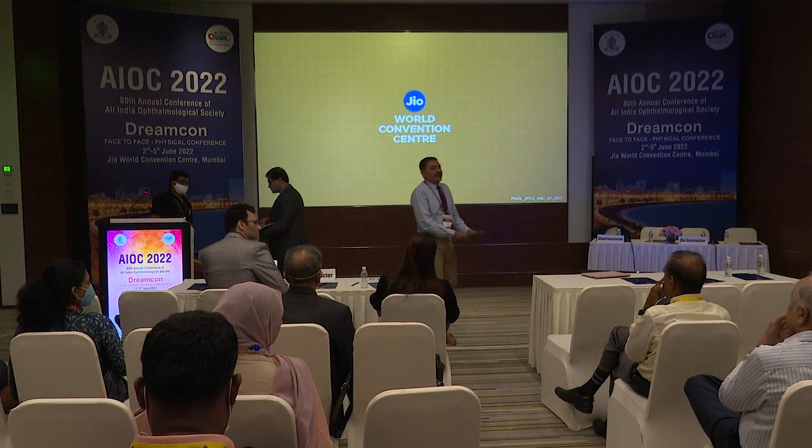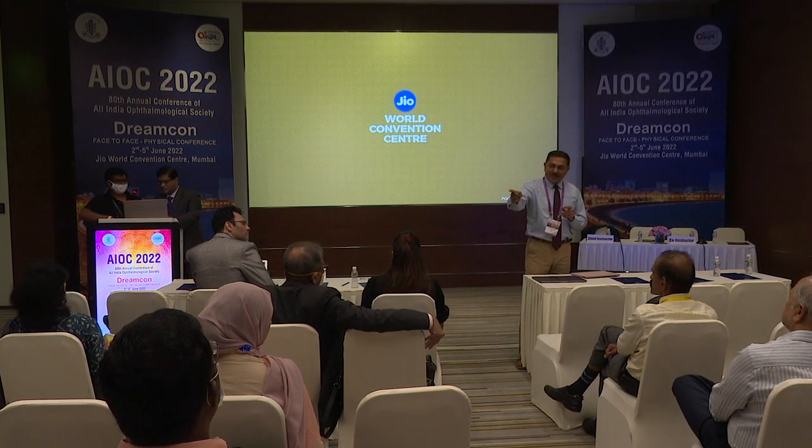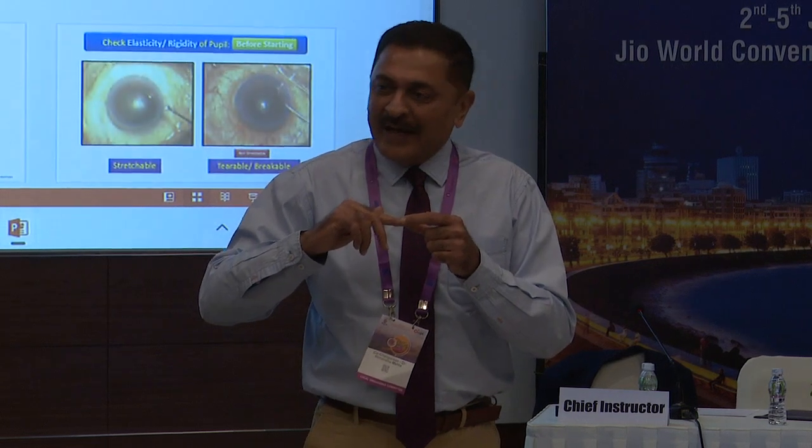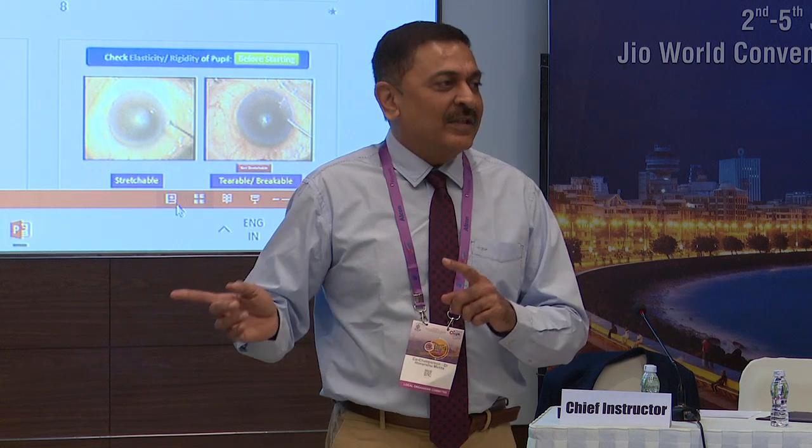Absolutely, I'm for it. Sir, any which way the AC remains stable is your best friend. So going in and coming out as little as possible. If you saw, quite often I came out of my side port because it starts leaking after some time. And he has shown something beautiful. The size of your side port and the incision which you make from the side should coincide. It shouldn't be bigger. Am I right? Rohit, please expand. You are showing that now. Great. This is a very practical point, so that your iris doesn't keep coming out with you.